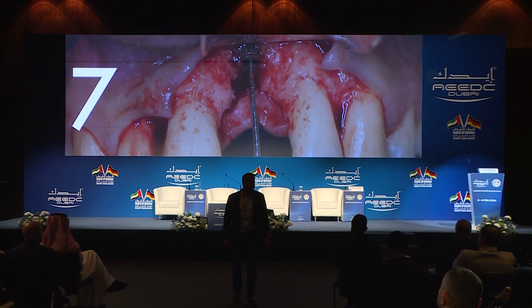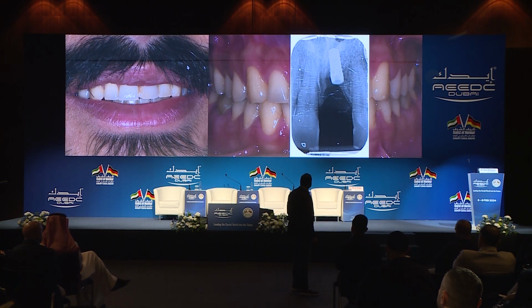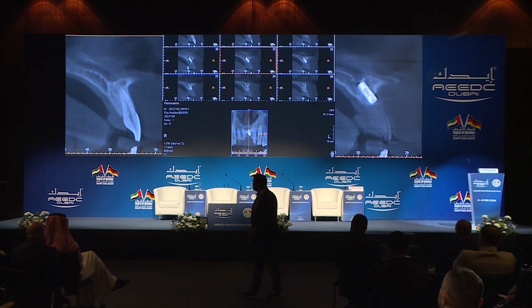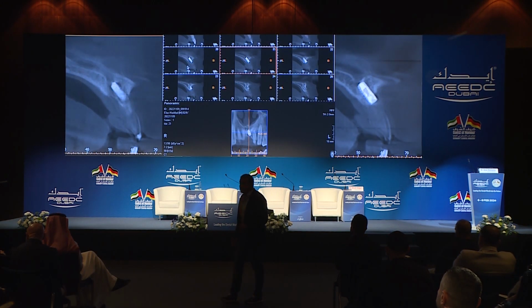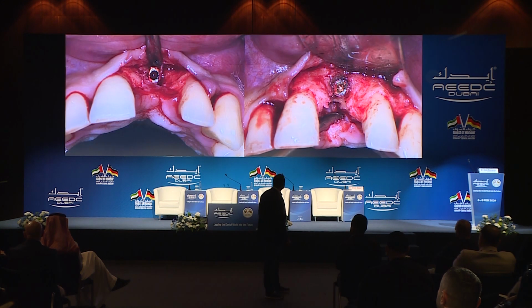And in cases where it's really advanced, like an advanced bone loss and very bad implant placement, I would like to play the role of hero sometimes, but this is too much. In a case like this, look at this implant, man. This is a young guy, 25 years old, and when you look at the CBCT, the implant is really placed where the bone is, not where it's supposed to be. In these cases, don't try to be a hero, just remove the implant, because you cannot do it.